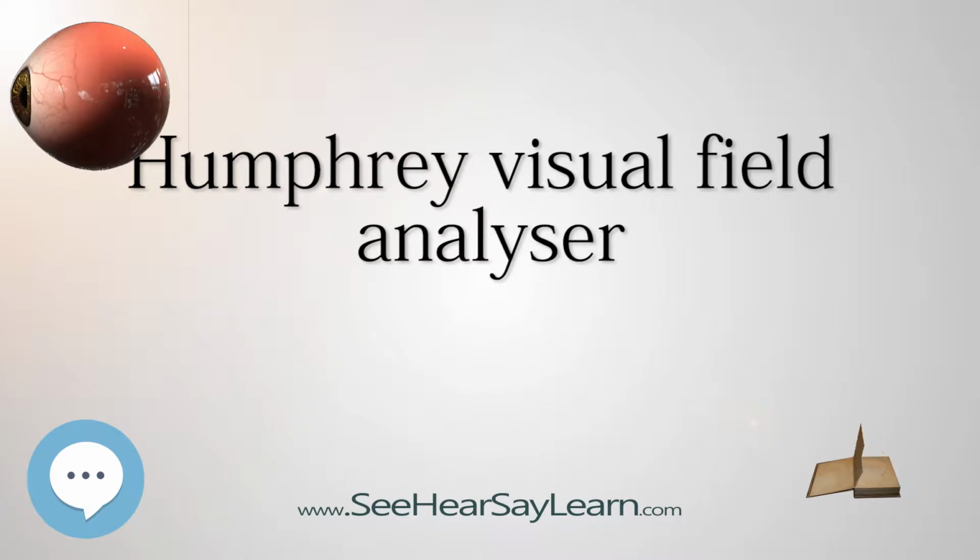They include 10-2, which measures 10 degrees temporally and nasally and tests 68 points. Used for macula, retinal and neuro-ophthalmic conditions and advanced glaucoma. 24-2 measures 24 degrees temporally and 30 degrees nasally and tests 54 points. Used for neuro-ophthalmic conditions and general screening as well as early detection of glaucoma.